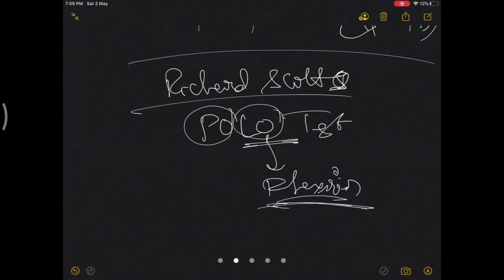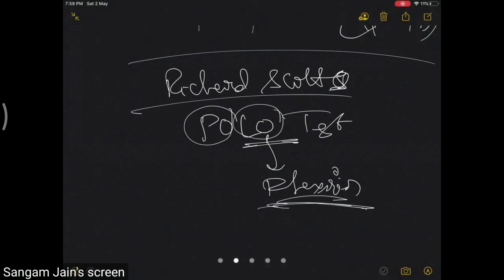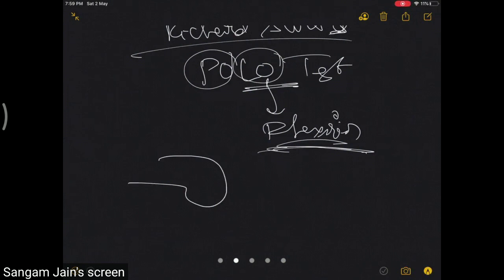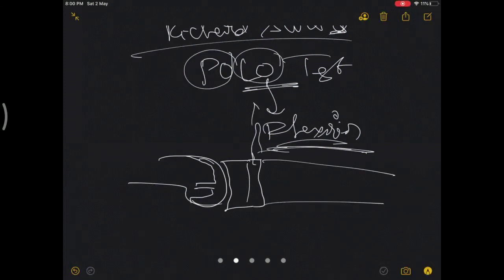You use a pegless trial base. You have a femur, a trial implant and a trial base plate, pegless trial base plate. This is how the trials look. This has a handle which you keep, and then you take it off.